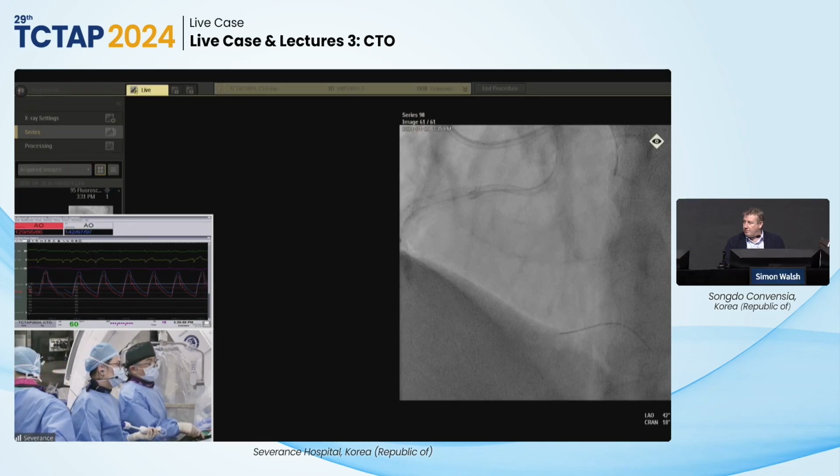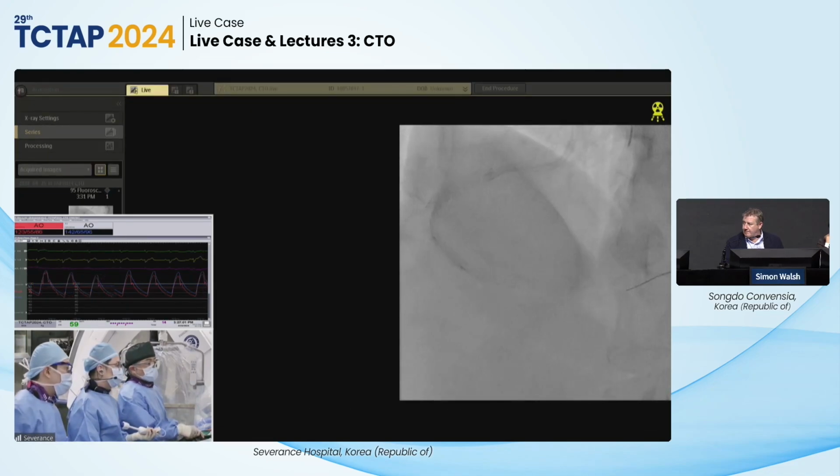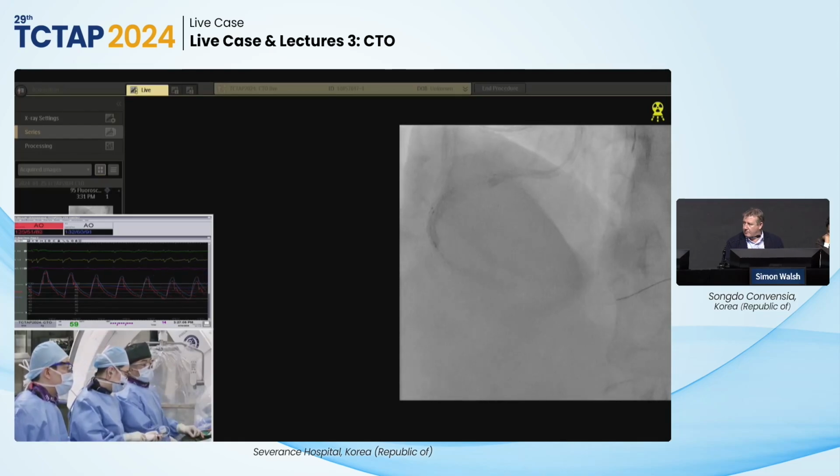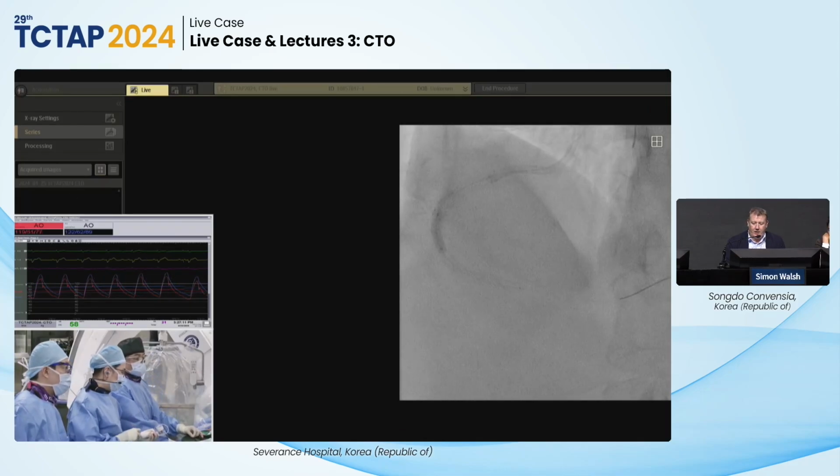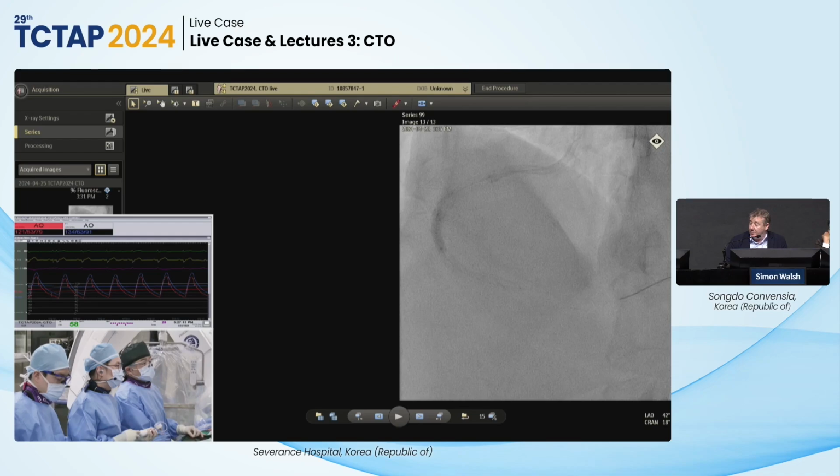Honestly, the stent was landed in a very healthy segment, and distal there's some plaque. I don't think that if you bring the patient back, the FFR would be positive. I think you can just leave it. Yeah, I think you can also see how the patient does symptomatically. And if the patient's doing well symptomatically, you don't have to chase after these things.